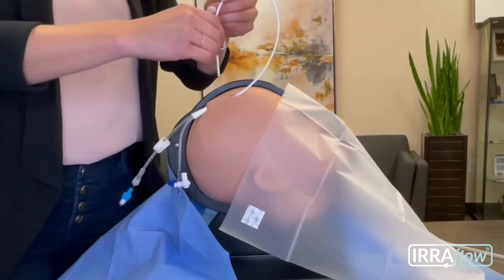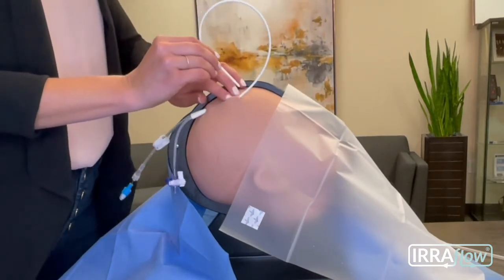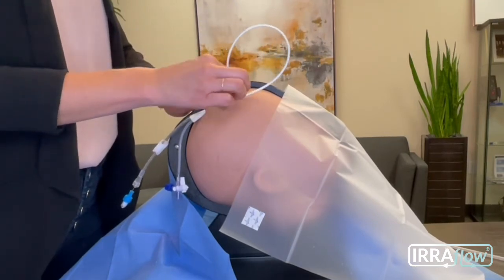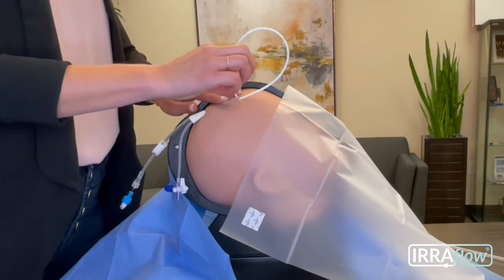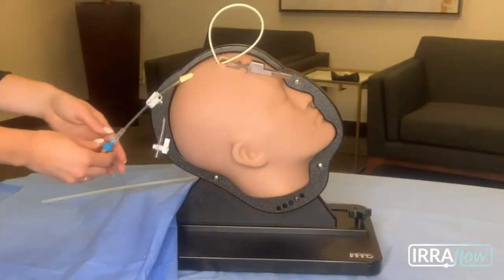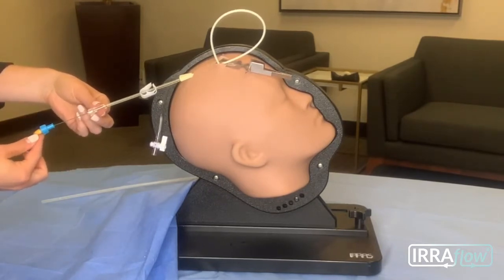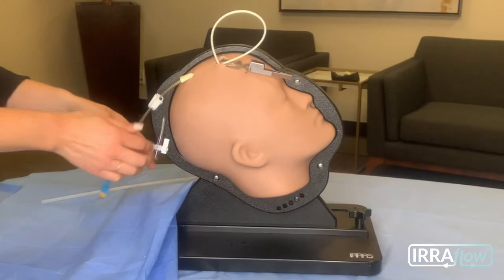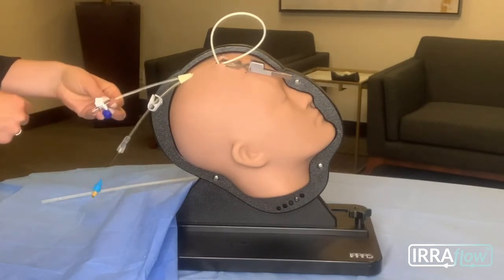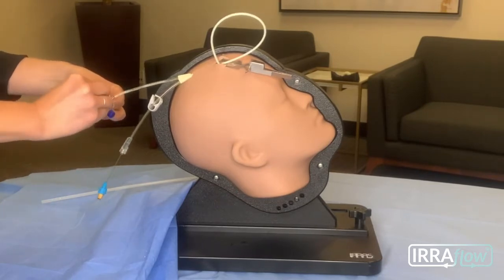The catheter is going to turn up on top of itself, aligning to your trajectory. Holding the catheter between the 5 to 7 centimeters mark, use the straight section of the catheter to line up to your external landmarks, leaving the large loop in place. Pull the soft stylet out of the drainage lumen approximately 3 cms, and open the stopcock on the irrigation lumen to check for CSF. Once CSF drainage is confirmed, make sure to clamp the lumen.